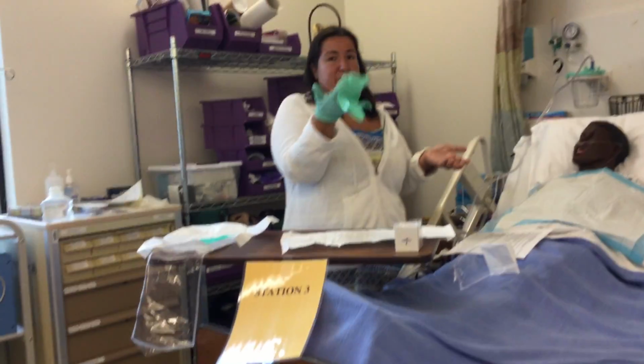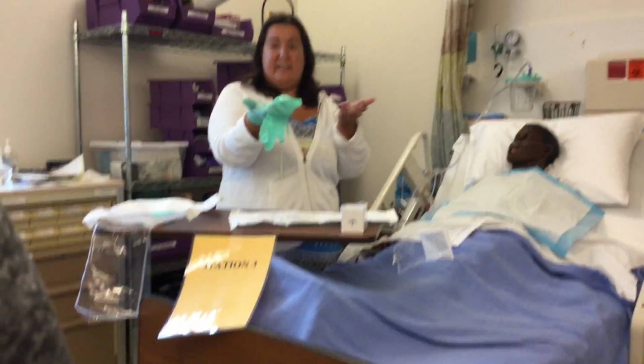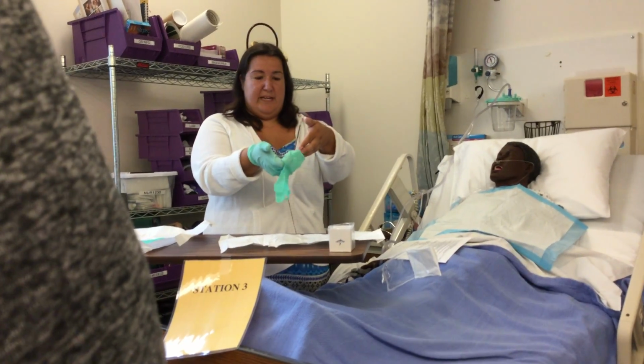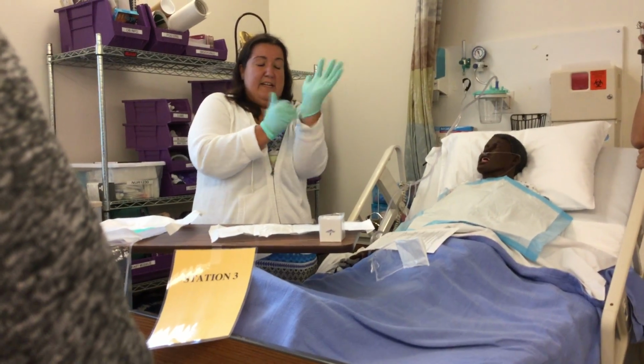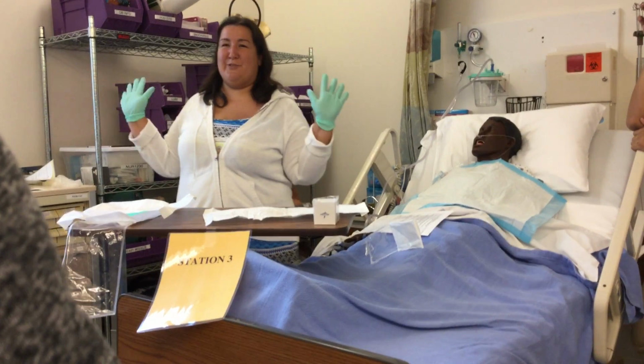So you've got your fingers in there, bring it up, so you're not tempted to drag this across this paper over here. Bring it up here, and there's really nothing you can contaminate. If you have it like this, it's not going to touch your sleeve. It's not long enough to do that. So then you put this thumb out. You very carefully put that on, and then let it be. Let it go. When I see people trying to fix this, that's usually where they go wrong.